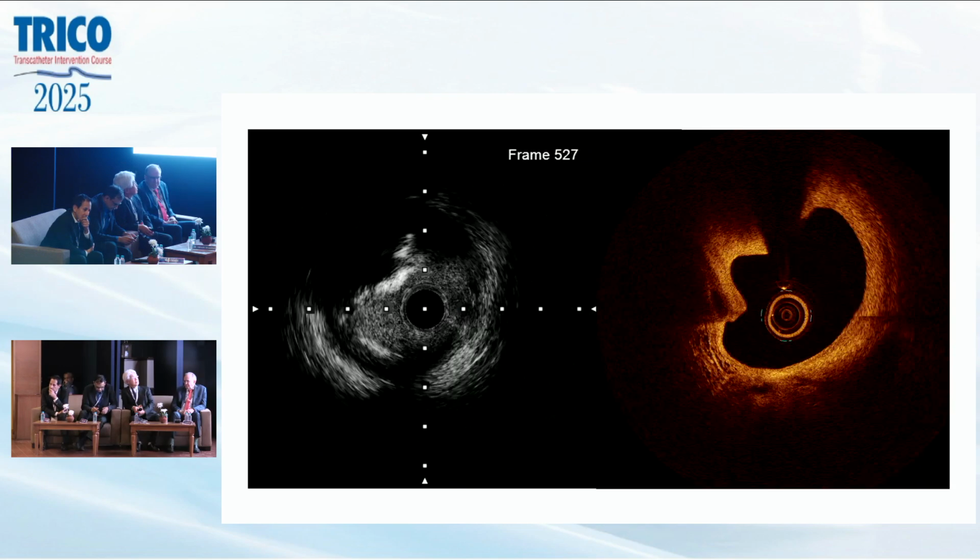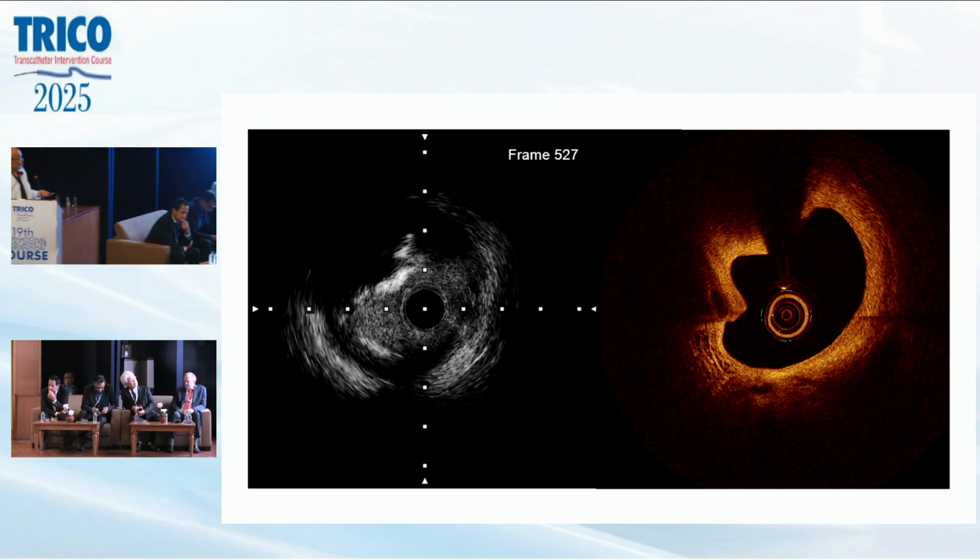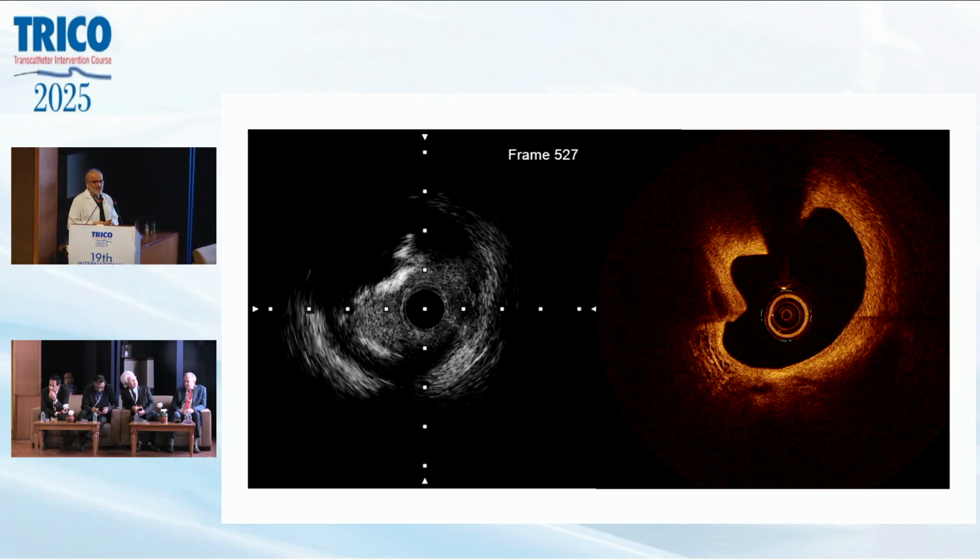it directly. This is the worst. This is the worst. And particularly this type of calcium, if you are using a non-compliant balloon, you will rupture a couple of them. You use an IVL catheter, there are great chances that it won't work and you may rupture it because of a lot of fibrosis all around. And this is a nodule which is very sharp, and most of the pulses will be wasted.